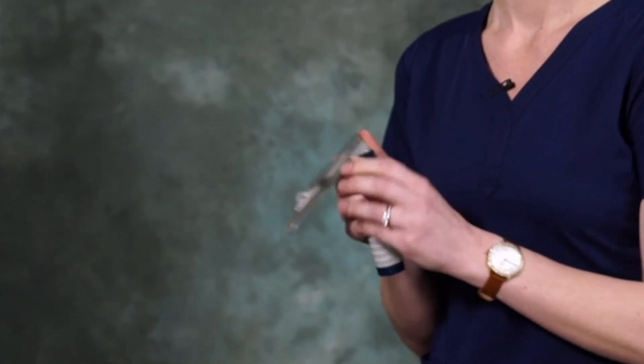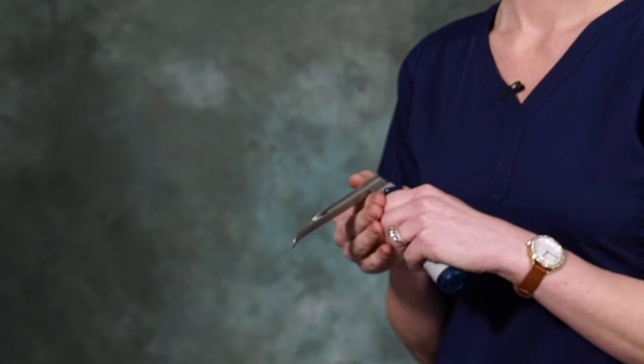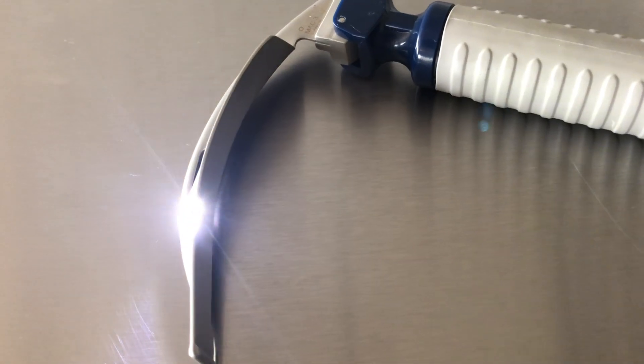The metal blade will ensure that it stays rigid during insertion. Thanks to our advanced cool LED lighting, you're going to have advanced visualization of the tissue while ensuring that the light does not heat up during use. And over to Eric.